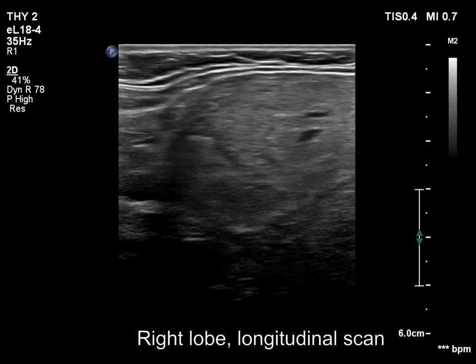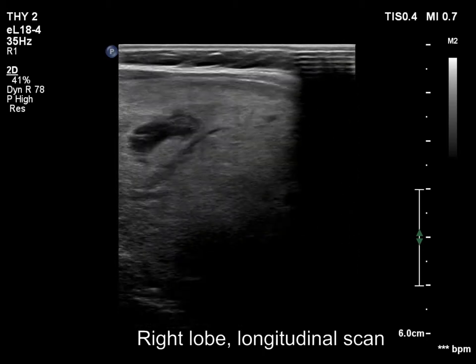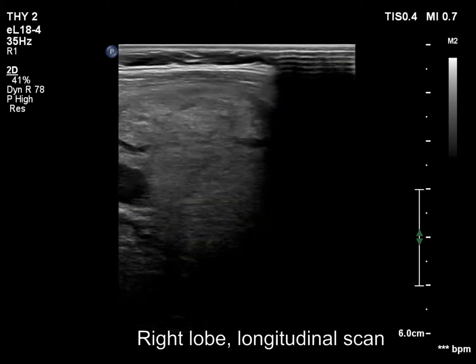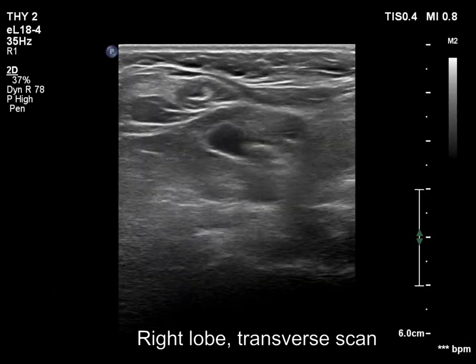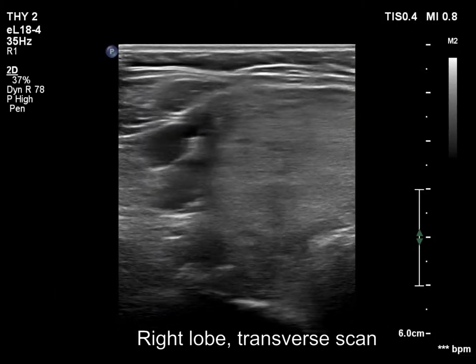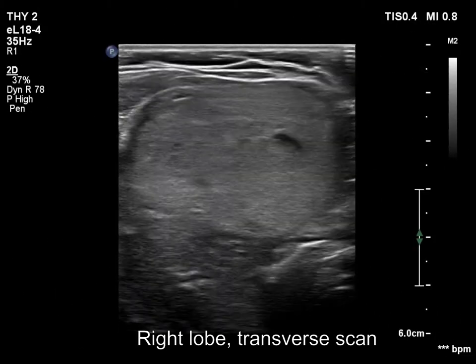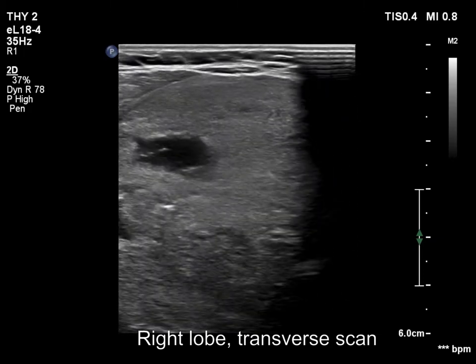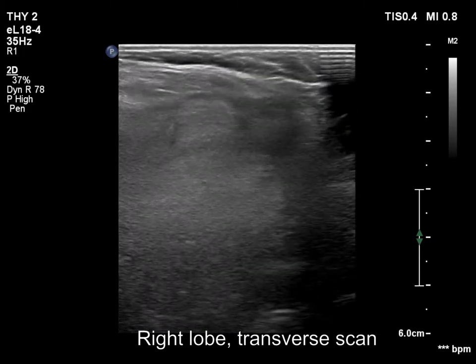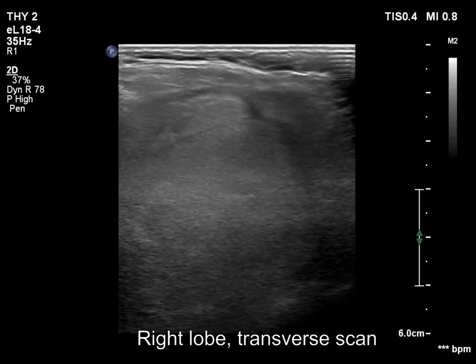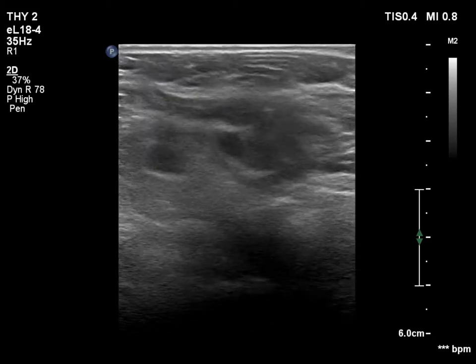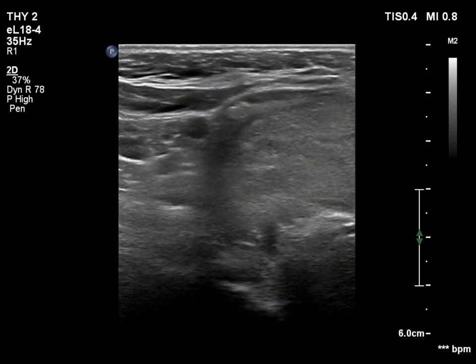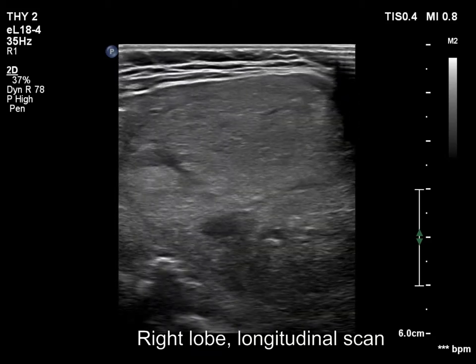The best resolution is not the appropriate setting in such a large goiter. Now, the right lobe with better penetration. With this setting, a significantly greater part of the lobe is visible.